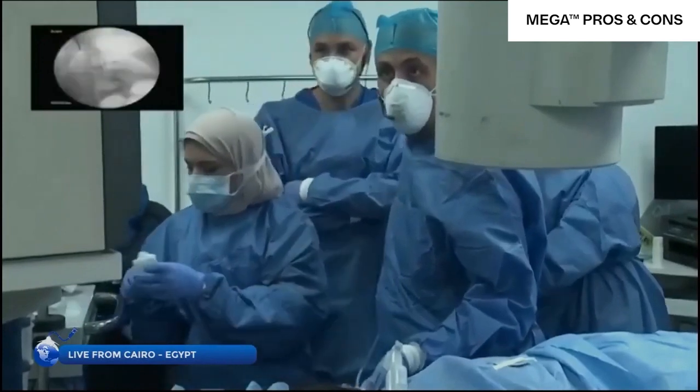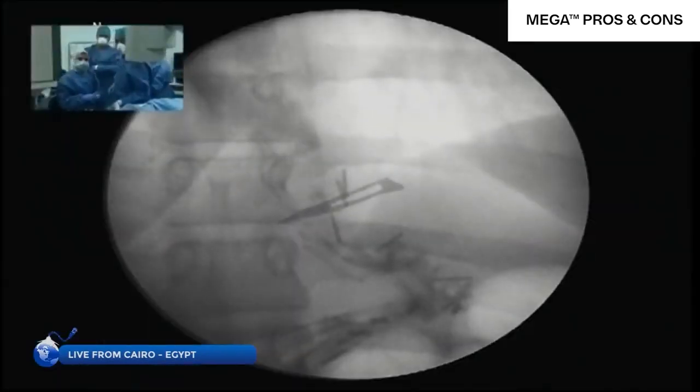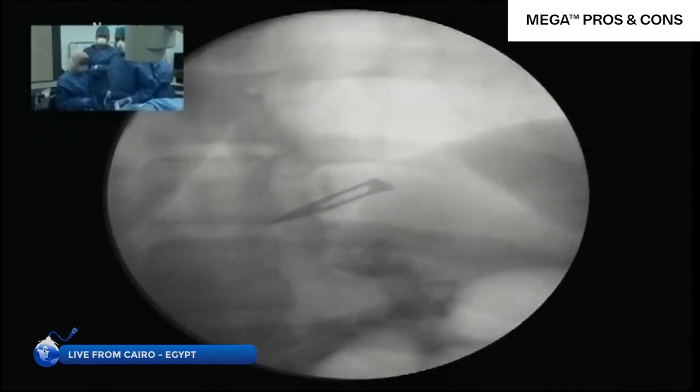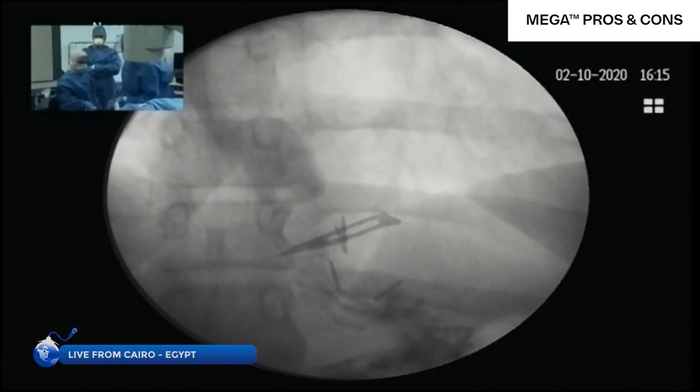This is very good. This is a real challenge. While I'm putting the stent, I just pull the guide wire. It's good to show that life is unfair, and sometimes this shows that we are doing a real patient, so expect this. So I will go again.